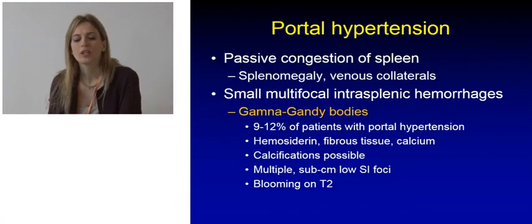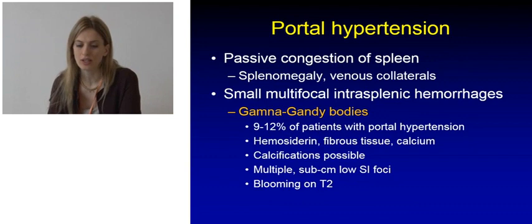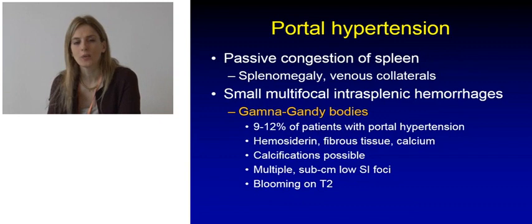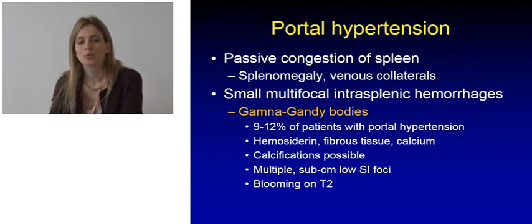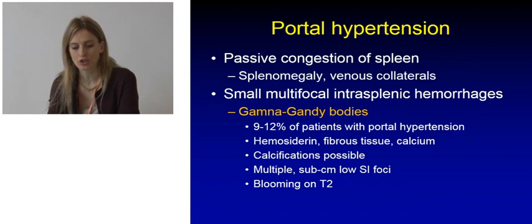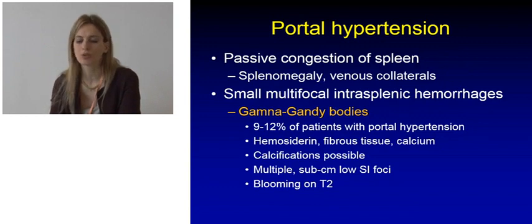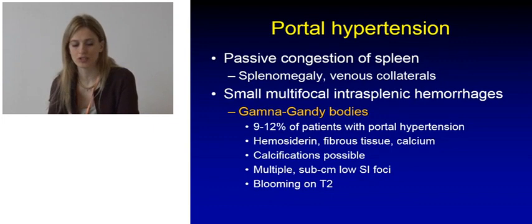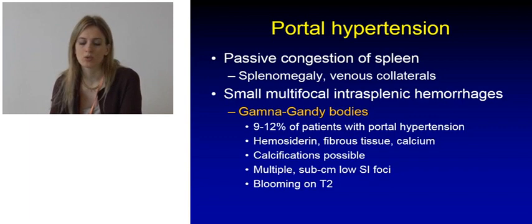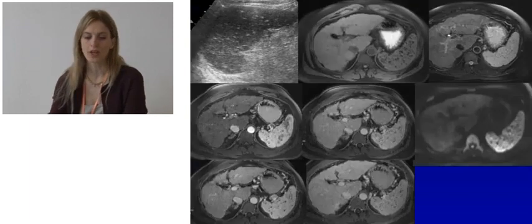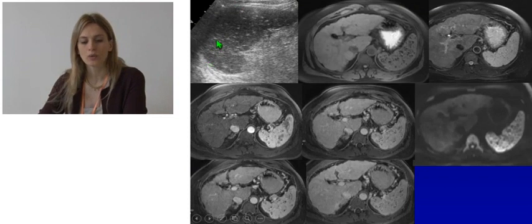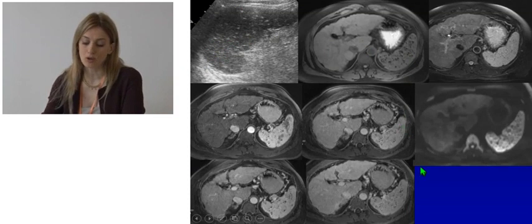Portal hypertension induces passive congestion of the spleen, resulting in splenomegaly and the presence of several venous collaterals. In the splenic parenchyma we can also appreciate small multifocal intrasplenic hemorrhages and the so-called Gamna-Gandy bodies. These are seen in up to 12% of patients with portal hypertension and are made of hemosiderin, fibrous tissue, and calcium. They can also show coarse calcifications. On MRI, these appear as multiple low-signal intensity foci which show blooming on T2 images, as seen here in a large spleen with many small calcified nodules which appear hypo-intense on all MR sequences.